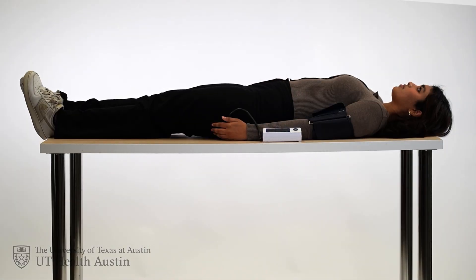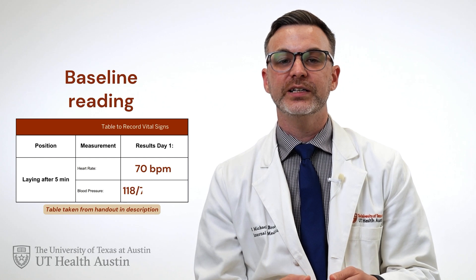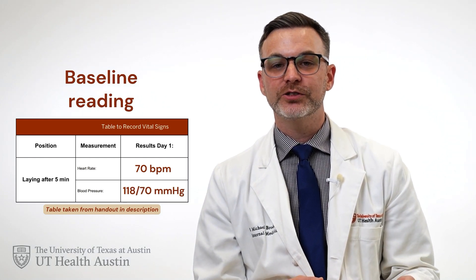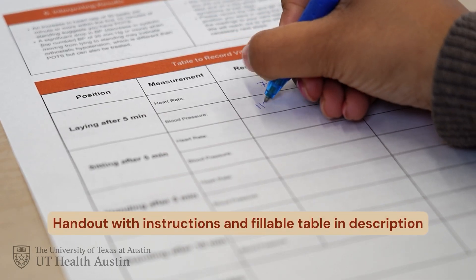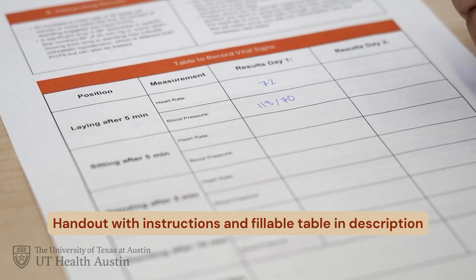So let's do your first baseline measurement laying down. To do this, lie down in a quiet and comfortable spot for five minutes. After five minutes, measure and record your heart rate and blood pressure. This is your baseline reading. For example, your heart rate is 70 beats per minute and your blood pressure is 118 over 70 millimeters of mercury. In the video description, we link to a handout that has these instructions, and on the back page we have a table where you can write down these results.